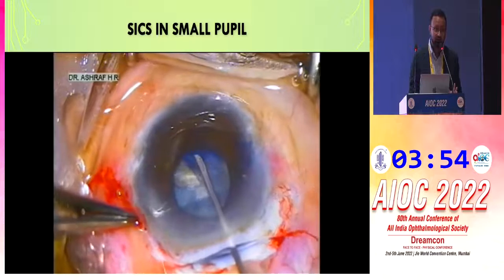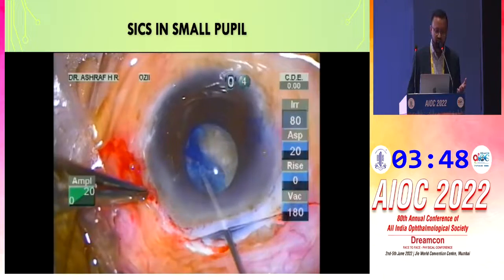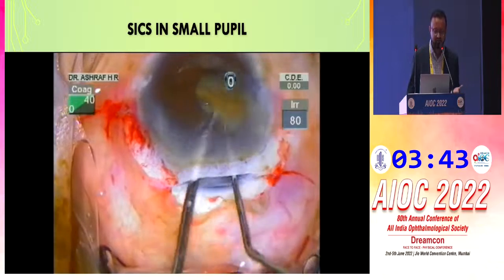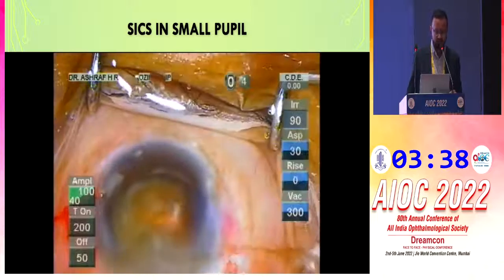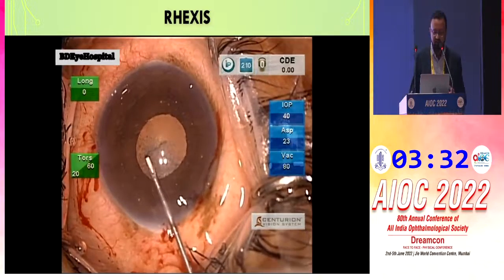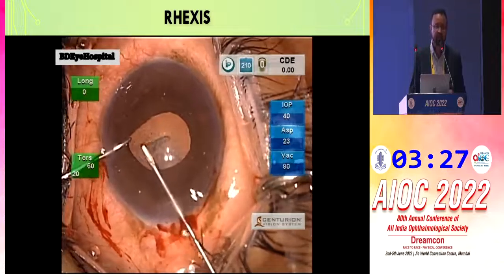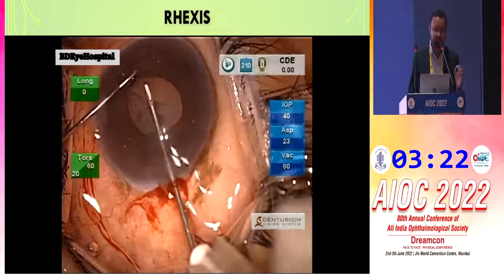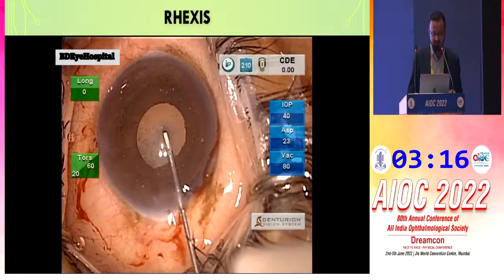We are talking about phaco, but in SICS we can easily manage the small pupil, even with a hard cataract. In SICS, the rhexis is beneath the iris and we just prolapse and explant the lens. In phaco, the rhexis is the most important step — using an iris guard with a Coghlan hook to visualize the rhexis margin, we can complete the rhexis below the iris properly.